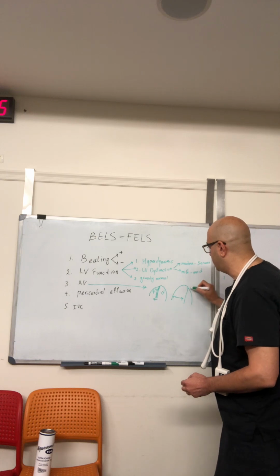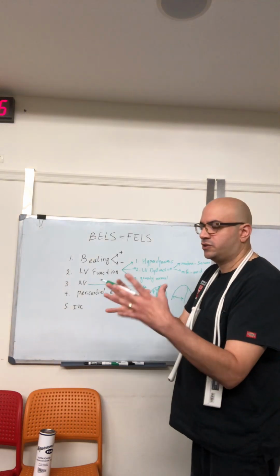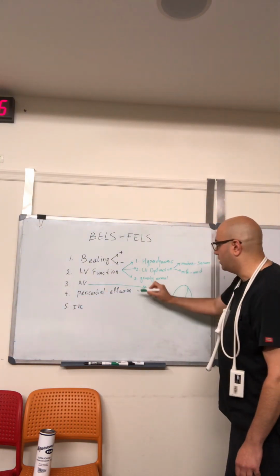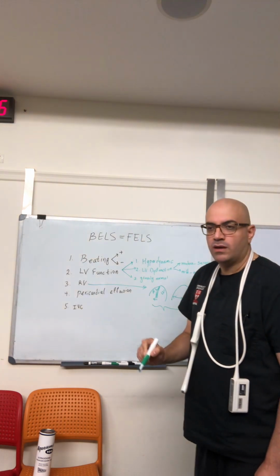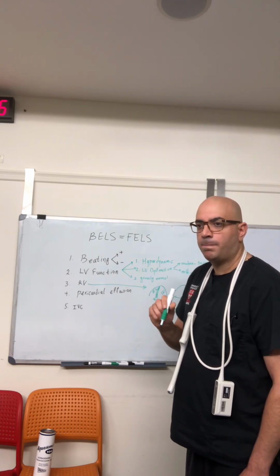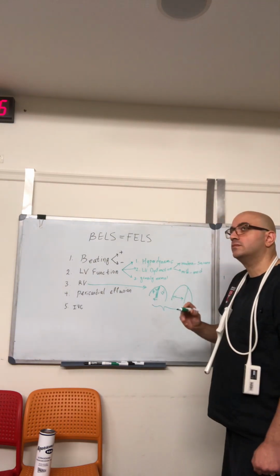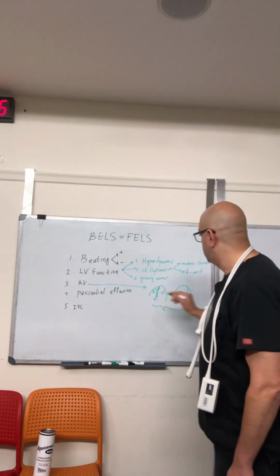And you can see LV is affected because of the high pressure of RV and the massive size of the RV. These are consistent with basically RV dysfunction and possibly an obstructive shock. Yeah, someone should run for this. It's not me today.